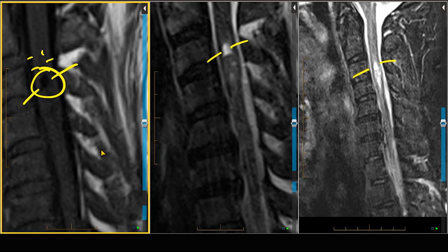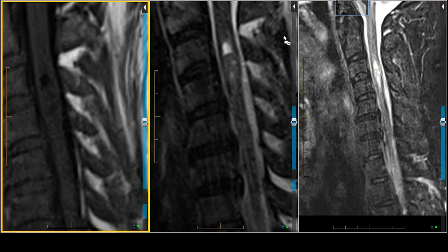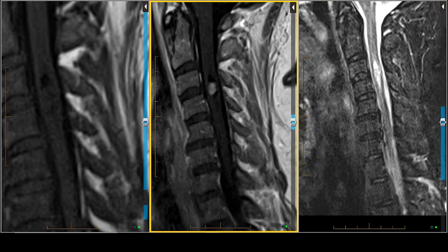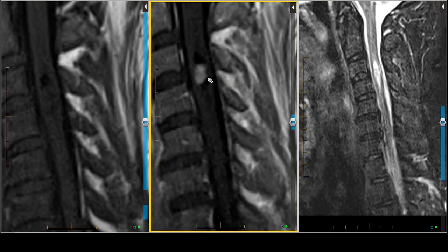Now, unfortunately, astrocytomas and ependymomas may have cystic areas. But let's look at the post-gadolinium-enhanced image on this patient. On the post-gadolinium-enhanced scan, what we see is a mass that has a solid area of contrast enhancement associated with the cystic area, and it's relatively well-defined and small in size.